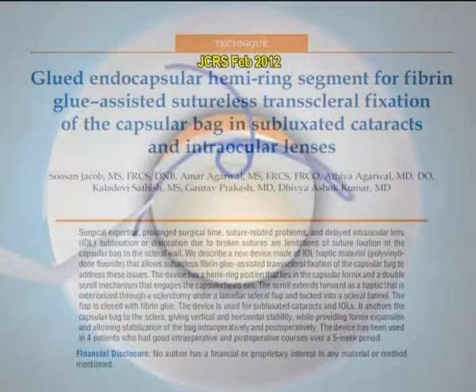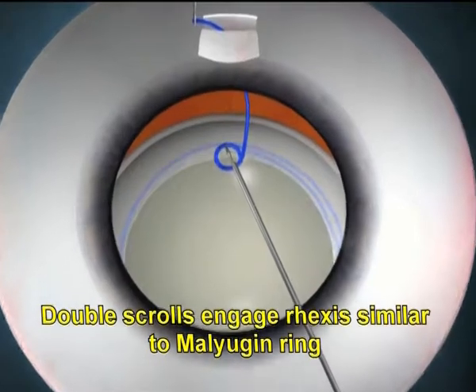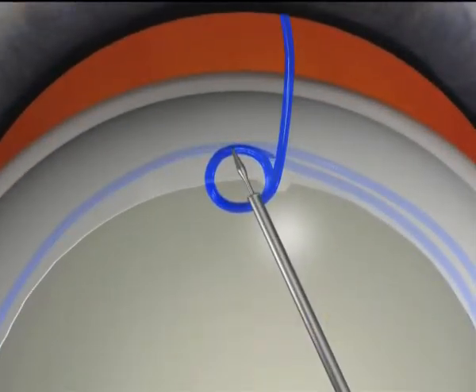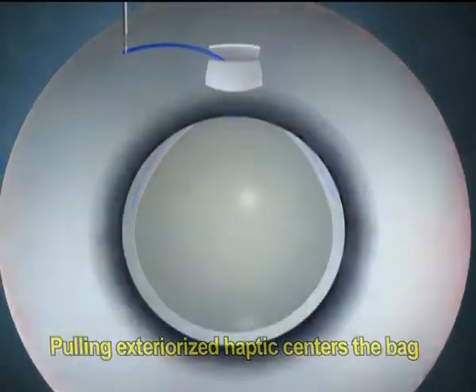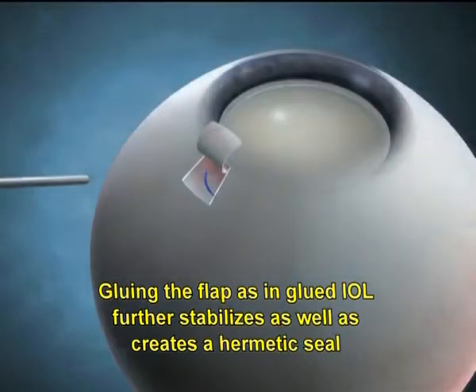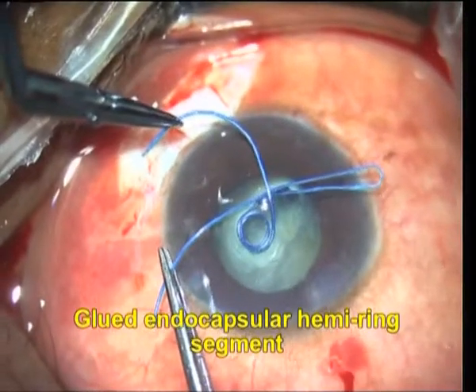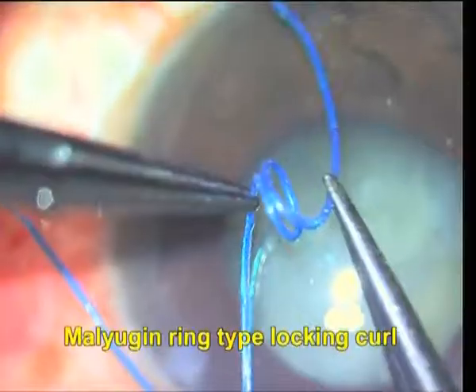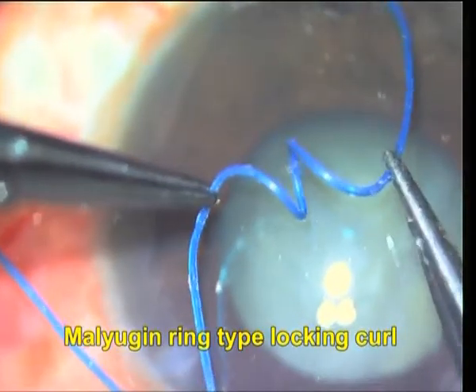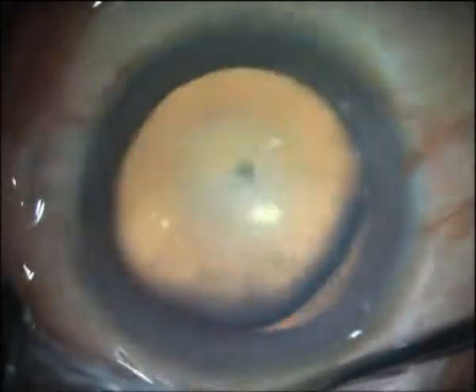We now describe this new glued endocapsular hemi-ring segment that we have designed for sutureless fibrin glue-assisted trans-scleral fixation of the capsular bag. This allows stabilization of the bag intraoperatively as well as postoperatively. This is a single-piece structure made of polyvinylidene fluoride wound into the desired configuration. We use this device in patients with subluxated cataracts.